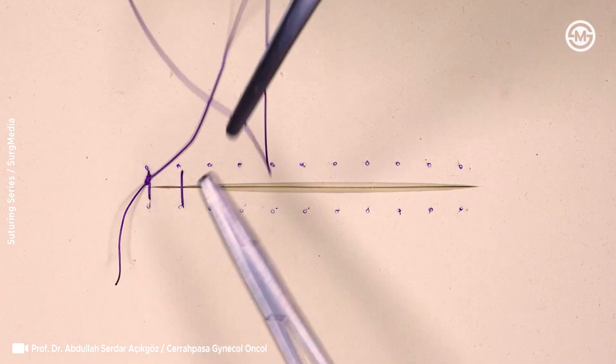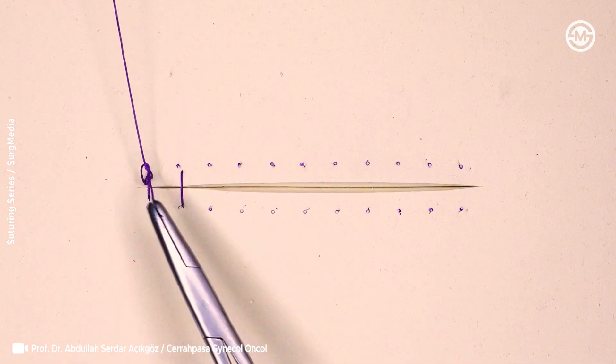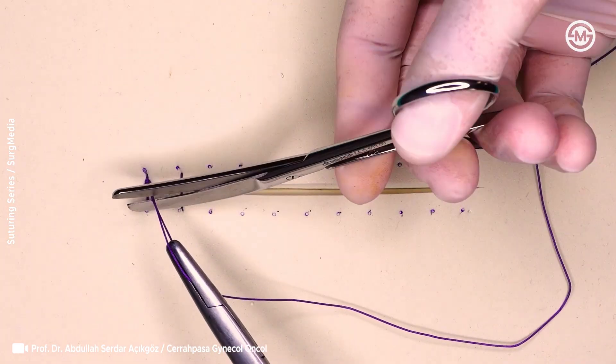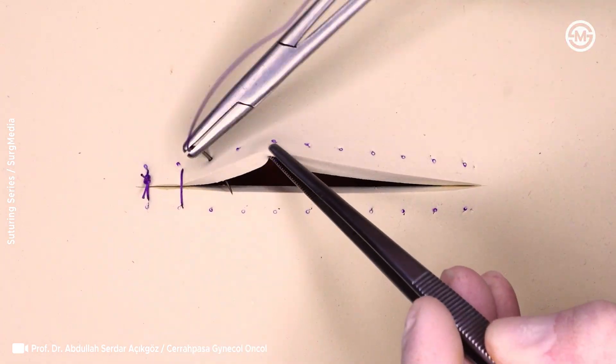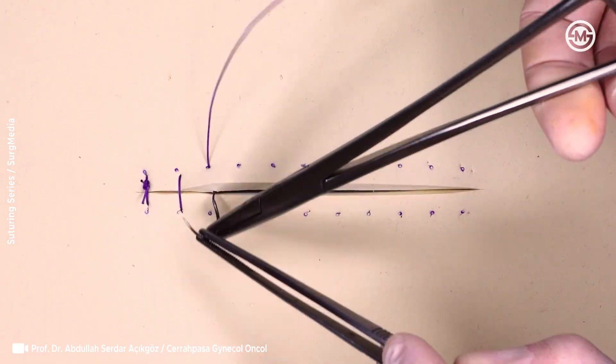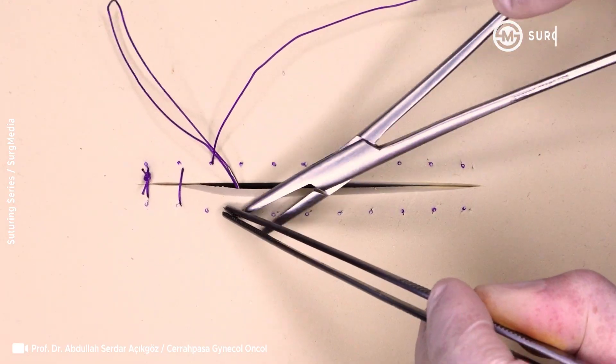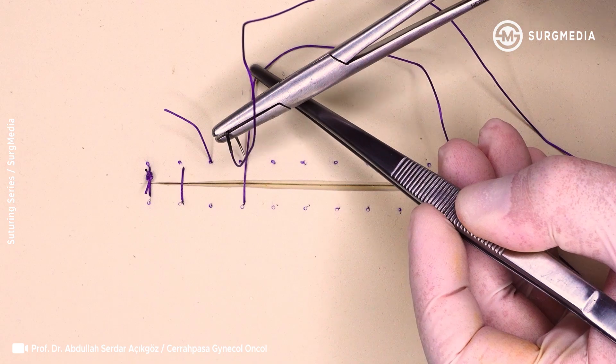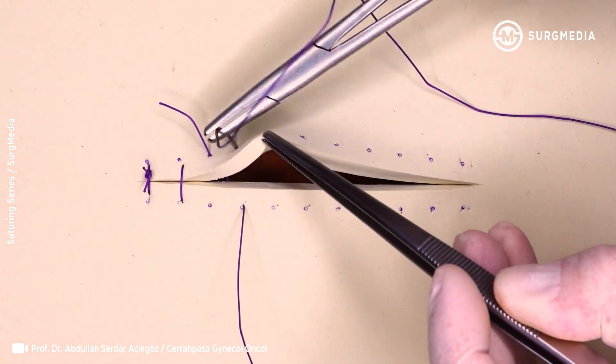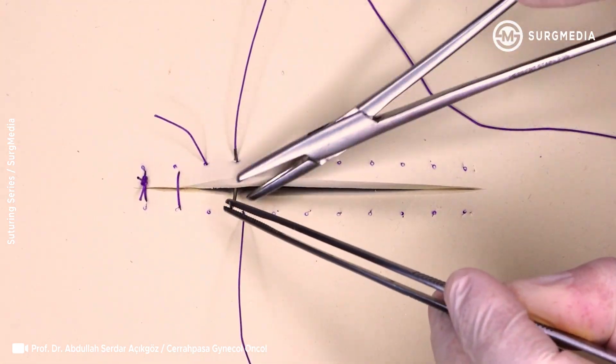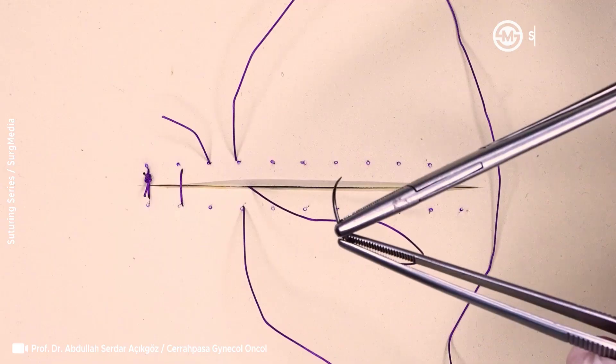The second pass comes up from below, directly across from where the suture exited, again placed obliquely, to form a parallel line. Once you tie the ends together, typically using a surgeon's knot, the final result is two parallel suture lines on the surface, but a crossing pattern hidden inside the tissue.